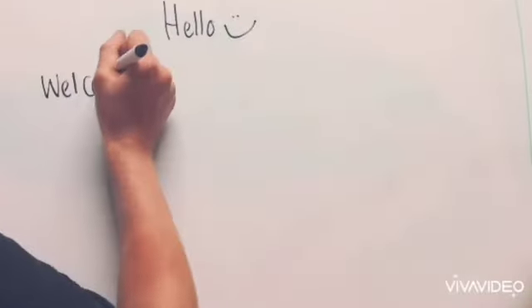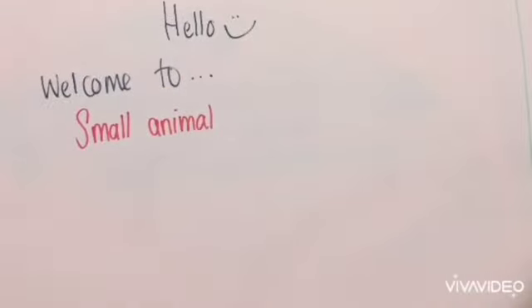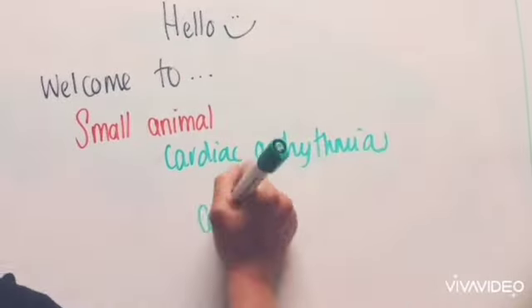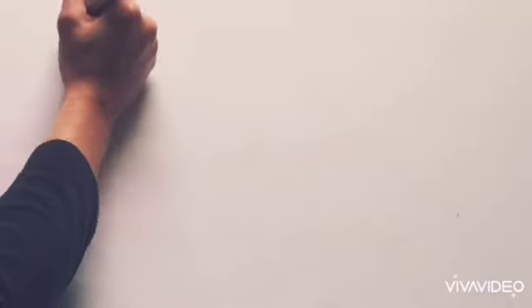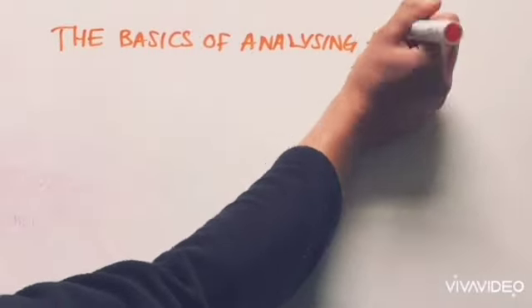Hey! Welcome to my talk on cardiac arrhythmias and conduction blocks in small animals. This is something that I feel I struggled with on rotation, so I hope you learn something new and enjoy the video. I'm going to start with the basics of analysing an ECG, just as a little refresher for you.